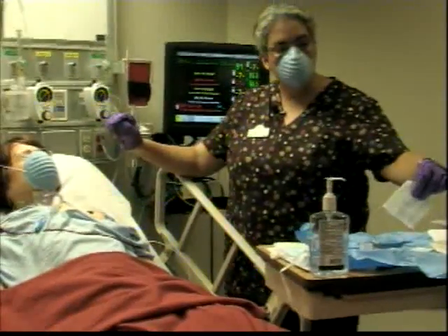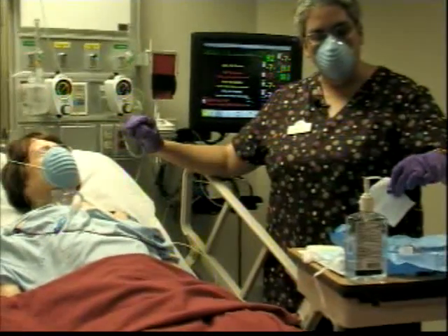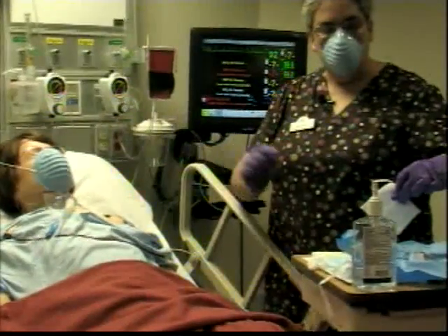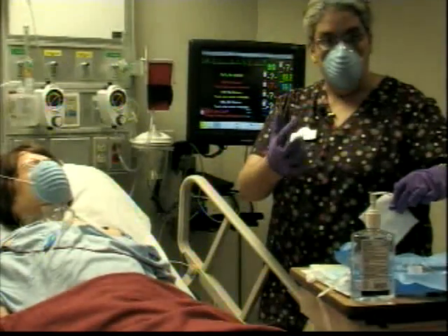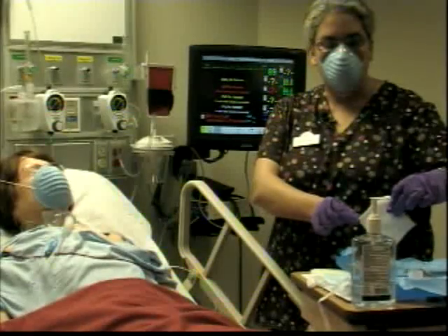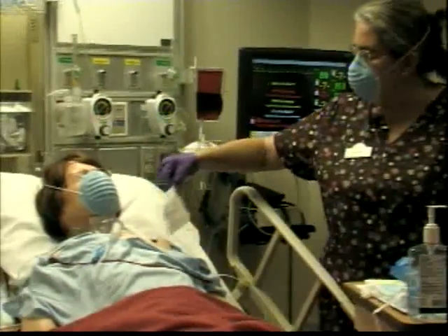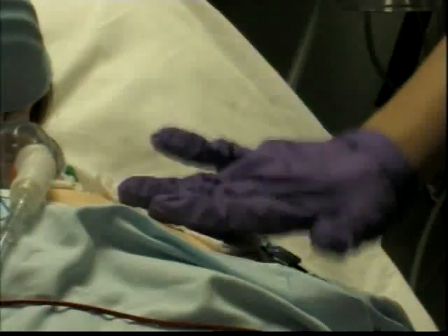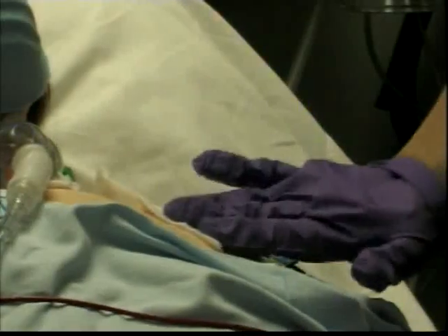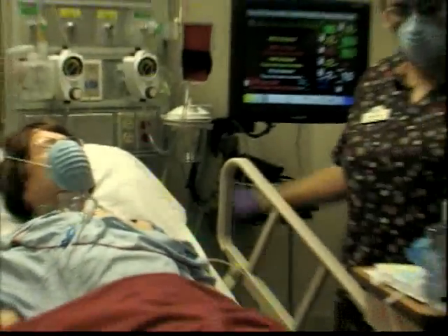So I'm going to use my 4x4. I'm going to bring it to my 1-inch border. That means that this part of the gauze is not sterile anymore, but neither is my hand. So I'm going to grab it within my 1-inch border. My hand remains in the same place. I put it on top and I pat it dry. I haven't contaminated anything. Pat it dry, remove, discard.